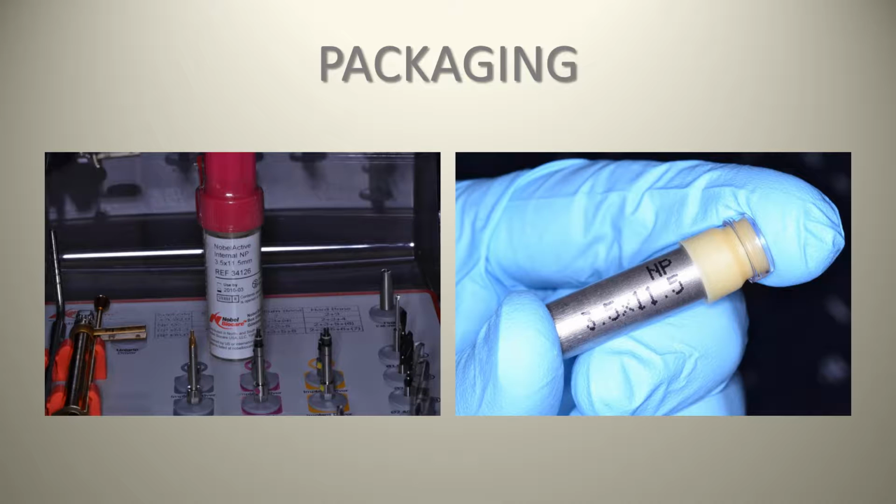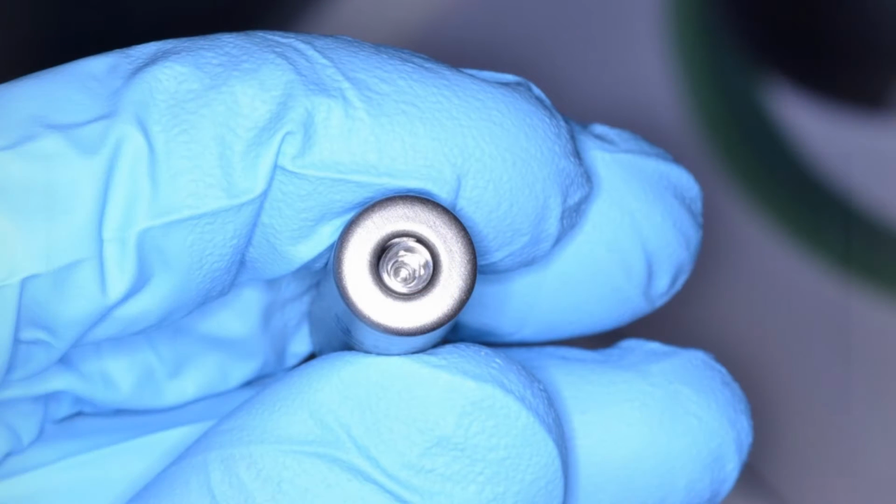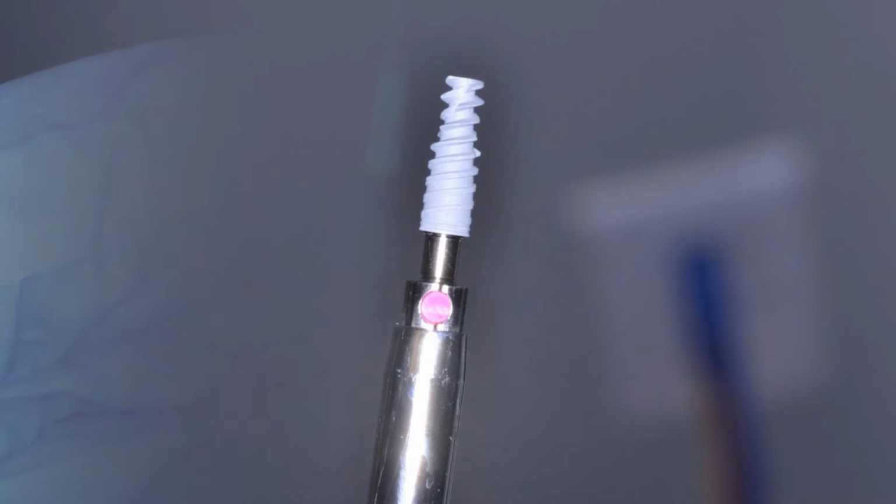As you snap open this little tube, what you see here in the picture on the right is another tube which can be placed into a sterile field really nicely. And inside here, if you go into the next slide, you'll see that once you pop that top off, you can access your implant. And using either a hand driver or the handpiece driver, one can engage that implant.